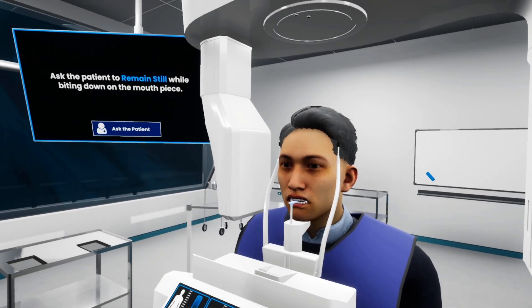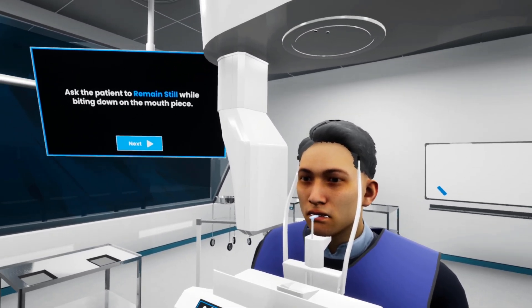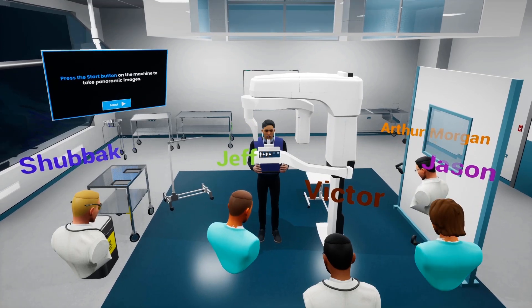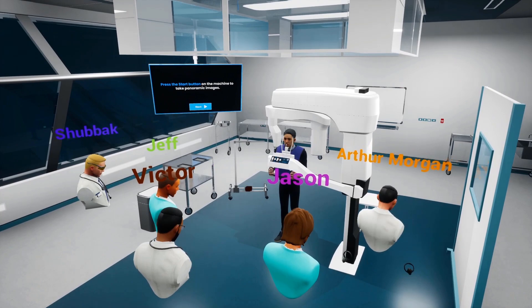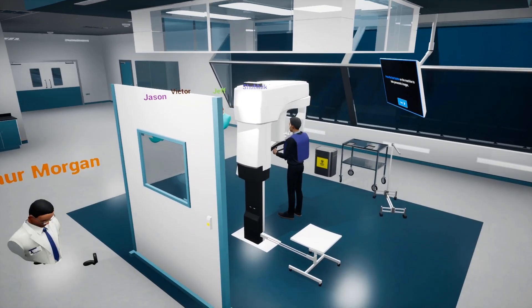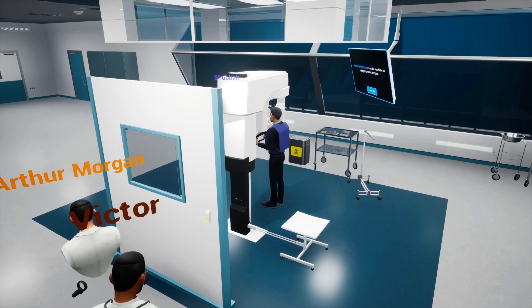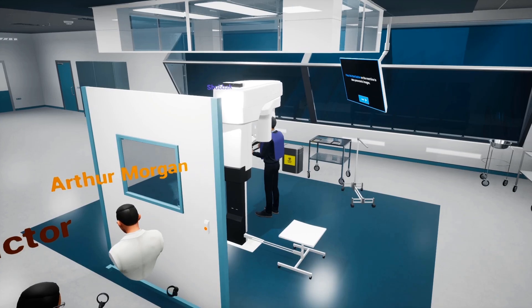We are now ready to take the panoramic image, so we ask the patient to remain still and inform him that he might hear some beeping sounds while the machine is running. As for the power button, there are usually two types. Some machines have their power button on a remote controller attached to the machine by a cable, and some machines have their power button installed in a far away place that is at least 6 feet away from the machine behind a wall. In either case, we need to maintain that distance away from the radiation while taking the image.